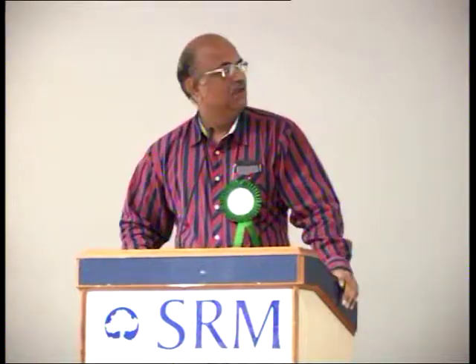We have discussed synchronization. Synchronization is nothing but when the patient initiates the breath, the machine should respond immediately and deliver the breath. So here we are avoiding asynchronization. Because of that, we will be able to ventilate a patient easily and weaning will be done faster.